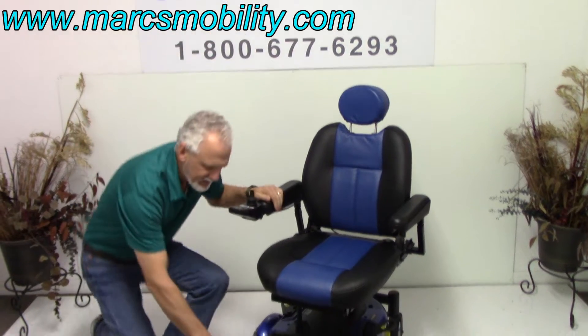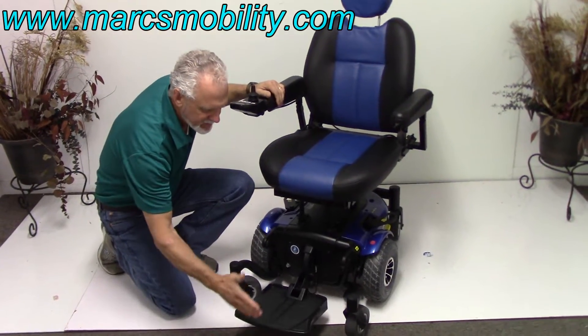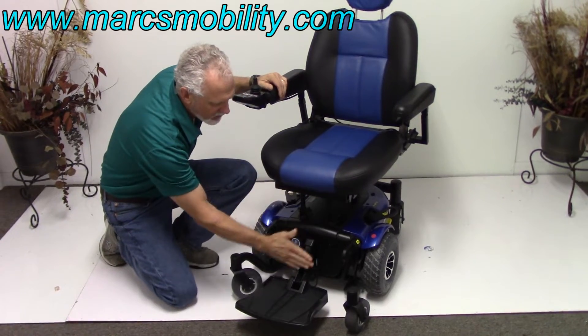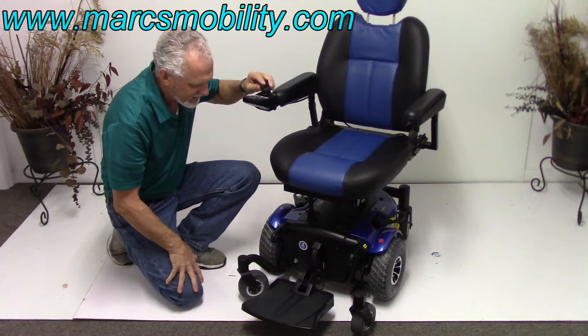You have a foot plate in the front that can be lifted for an easy exit. This foot plate can be brought in three inches — right now it's extended out, it can be brought all the way in so you're almost level. Right now they have it out for someone who needs a little more foot plate extension.